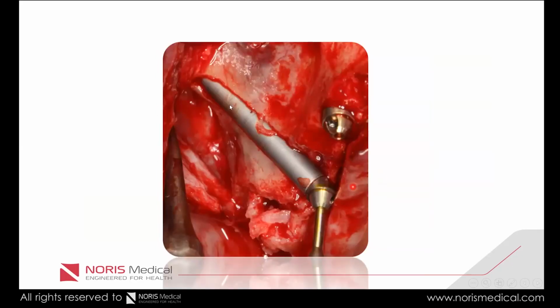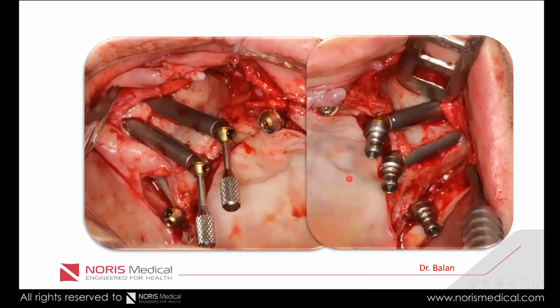And that's how it looks. We see the multi-unit very nicely positioned, and the multi-unit is in place. You see, this is the distance we took less, as I said before, the 2.5 millimeters less over here. And that's how it looks in life.